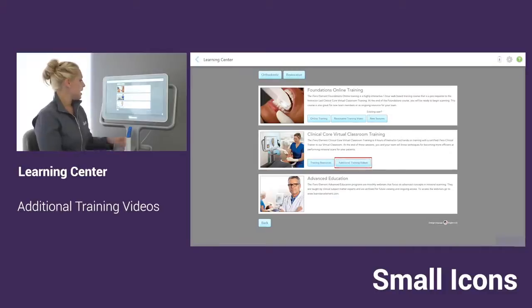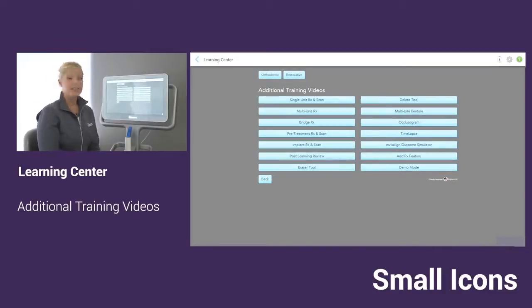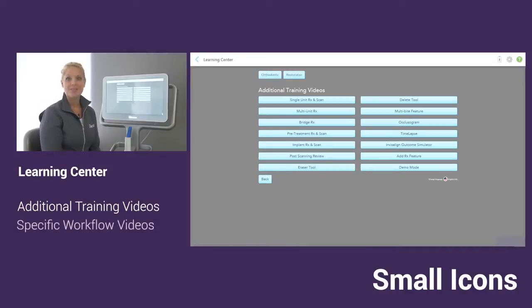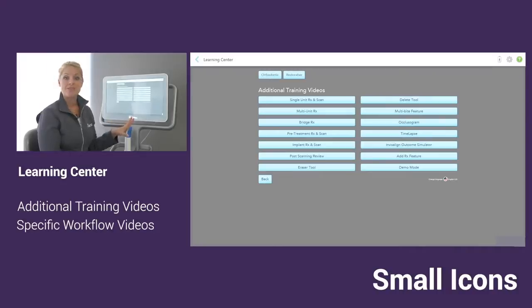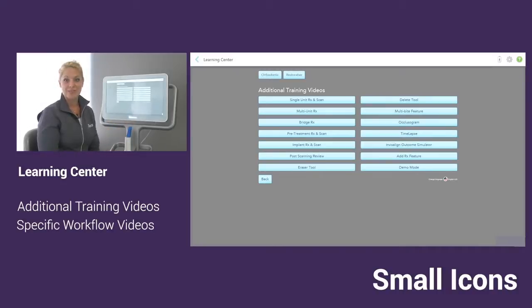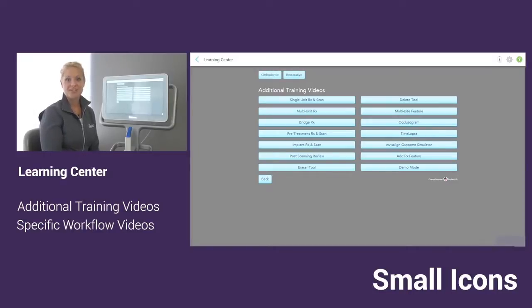Now in the middle, we have some additional training videos. On the scanner, we have a lot of great tools and features. What we did with all the additional training videos was basically broke down every single tool and feature and we put them into short videos so you can easily learn or maybe get refreshed on how to use them.